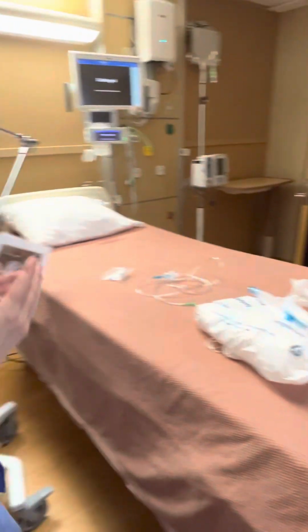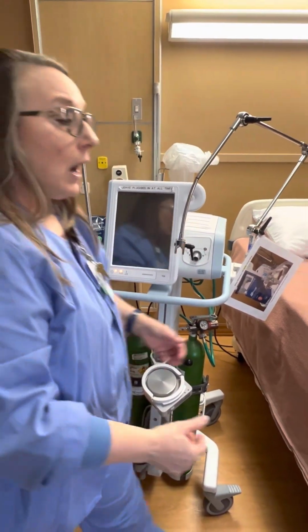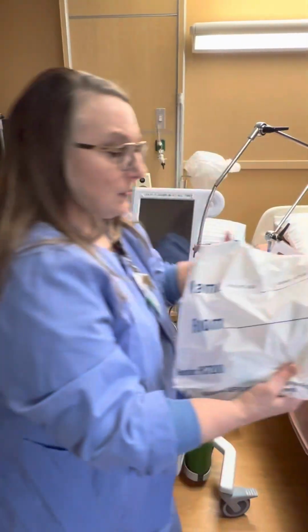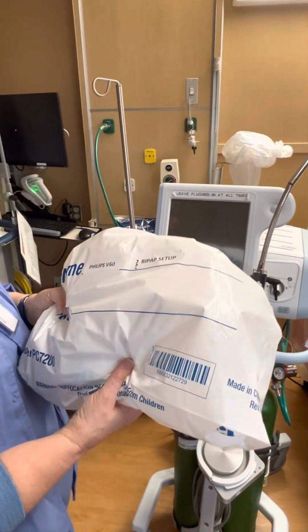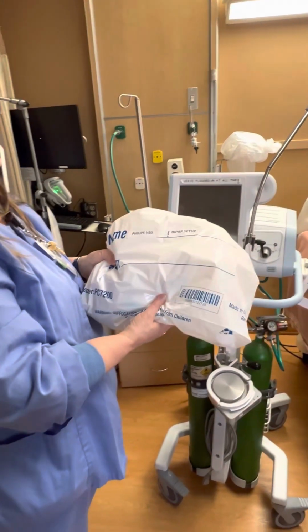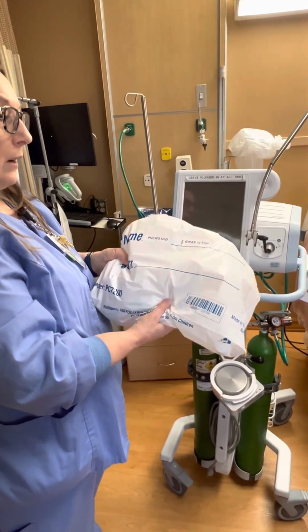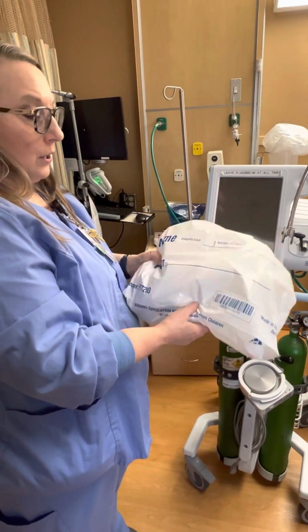You take the gray top and wipe everything down top to bottom. Now, I have set up grab bags. It says the Philips V60 BiPAP setup. I always have 2 extra ones in ER in their cupboard. I also keep 2 up in the CCU supply room. And if those run out for whatever reason, there's always extra up in the RT supply room.